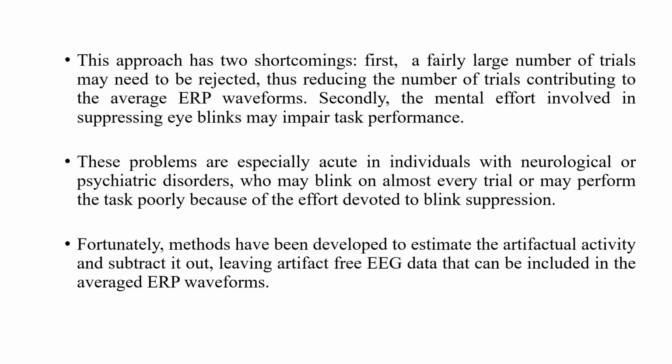Fortunately, methods have been developed to estimate the artifactual activity and subtract it out, clean the data, leaving artifact-free EEG data that can be included in the average ERP waveform.